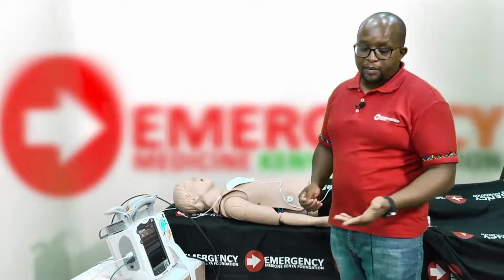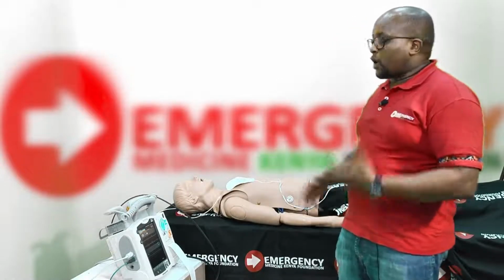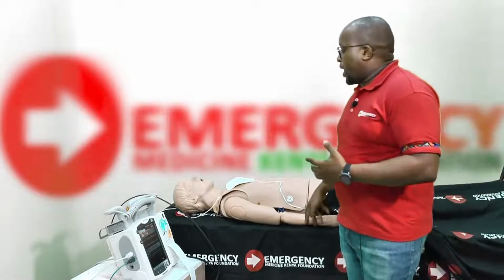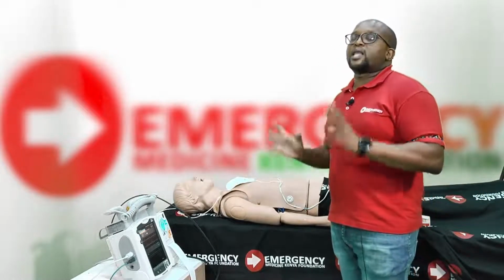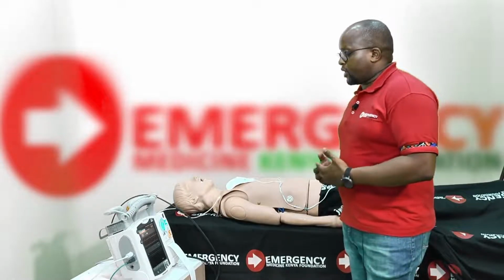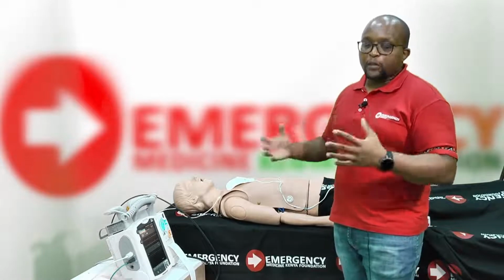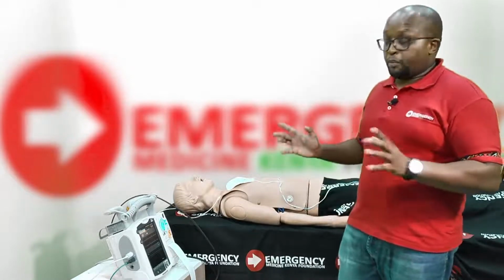Things like hyperkalemia. A lot of this you can pick up from history or do a quick blood gas for the patient, and consider other potential reasons for the patient's heart rate other than a primary cardiac problem. But if you cannot identify any other cause, then of course you should assume it's a primary cardiac problem, in which case your patient will need to be paced.